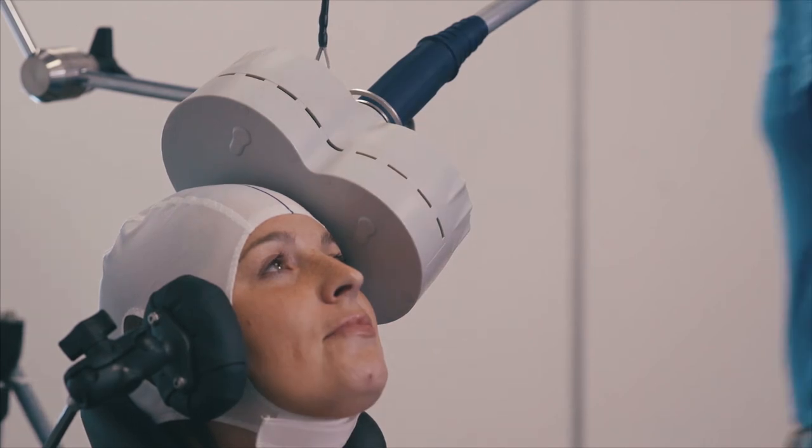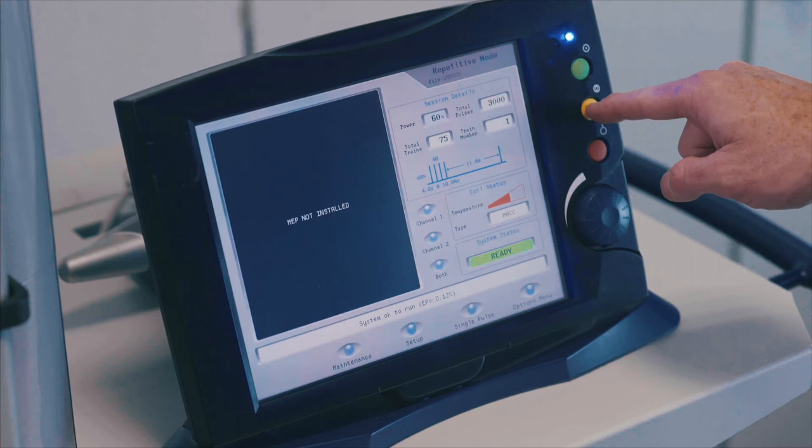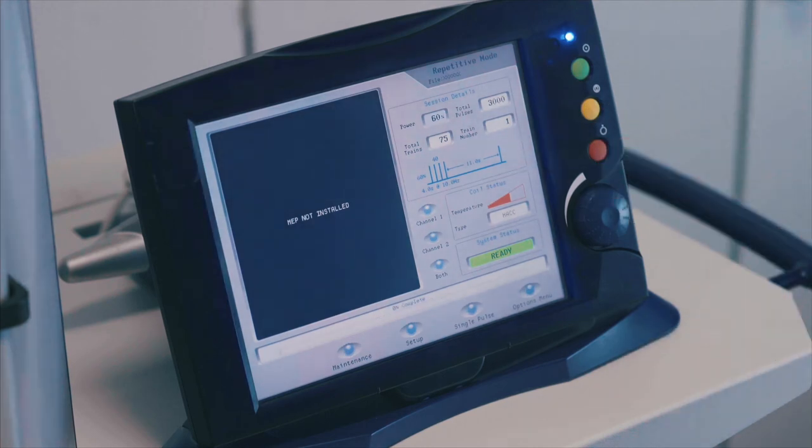Press the green Run button to charge the system and press the yellow Trigger button to begin the treatment. The coil must remain in contact with the treatment site throughout treatment.